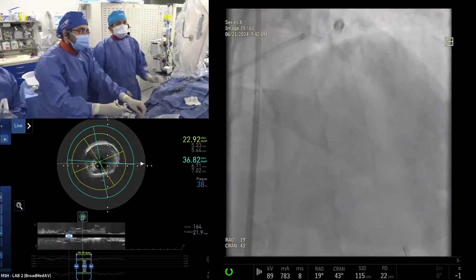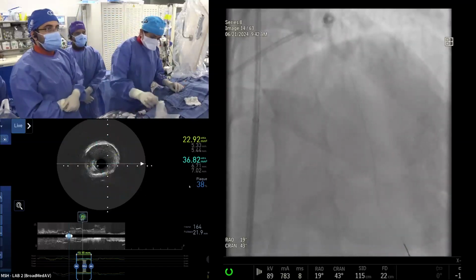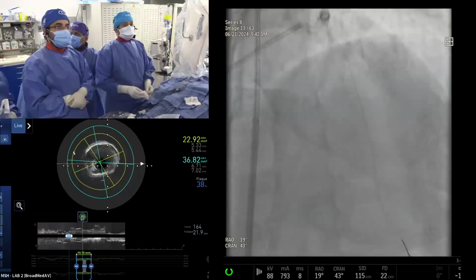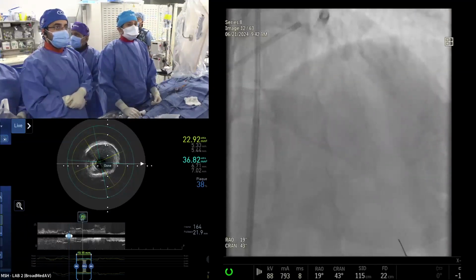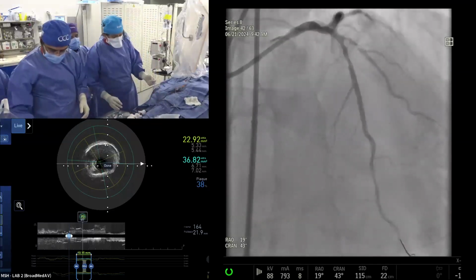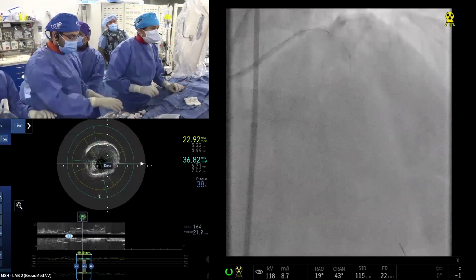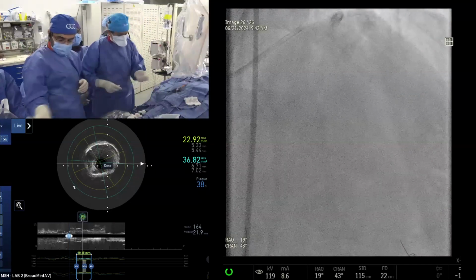The lesion is angiographically significant. Where is the lesion, guys? You have to go to the actual lesion. And this was the FFR significant lesion there. Everybody agrees? About 100% agreed. Good, there is no doubt, 0.75. Angiographically and physiologically both are significant lesions. Now the diagonal, definitely no question on the diagonal, and that is before.